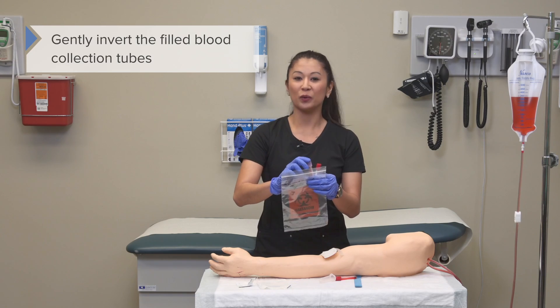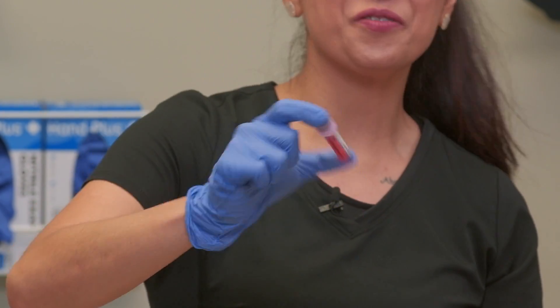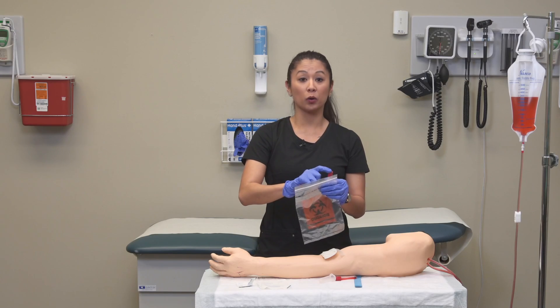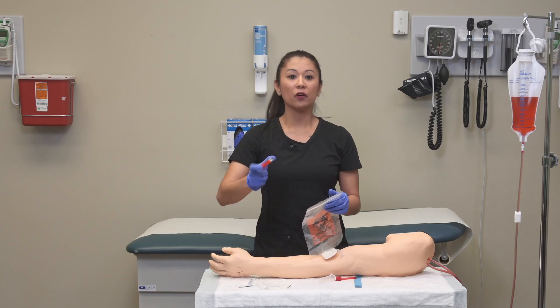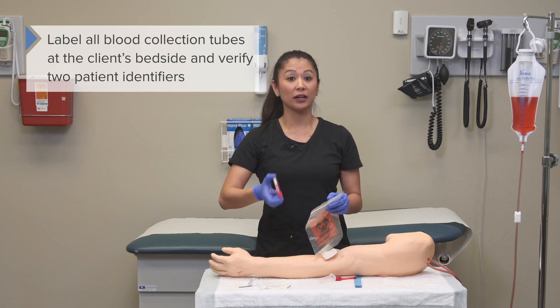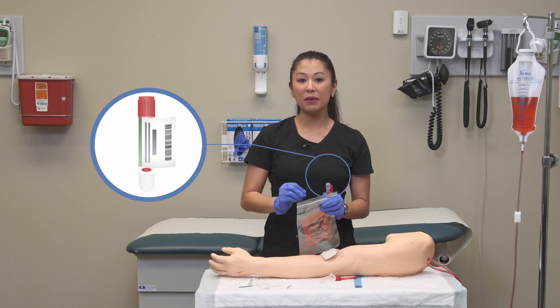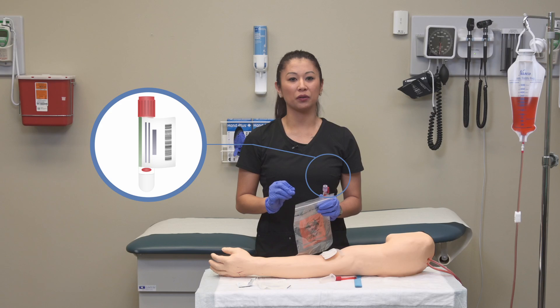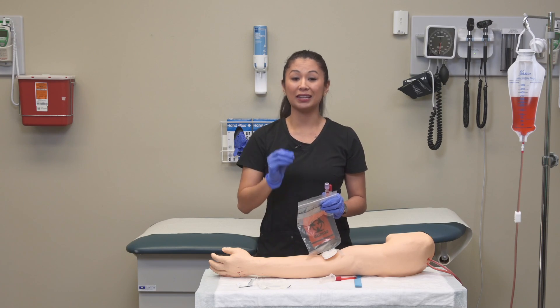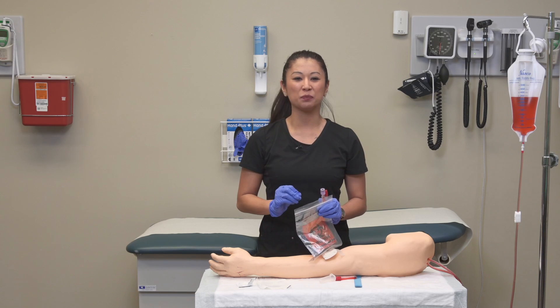When inverting the tubes, we don't want to shake them — simply take them and gently invert to mix the blood with the tube's additives. It's also important to label the blood collection tubes at the client's bedside to confirm the right patient and date of birth. Sometimes you can get the label from the electronic medical record or patient label — follow your agency's policy.